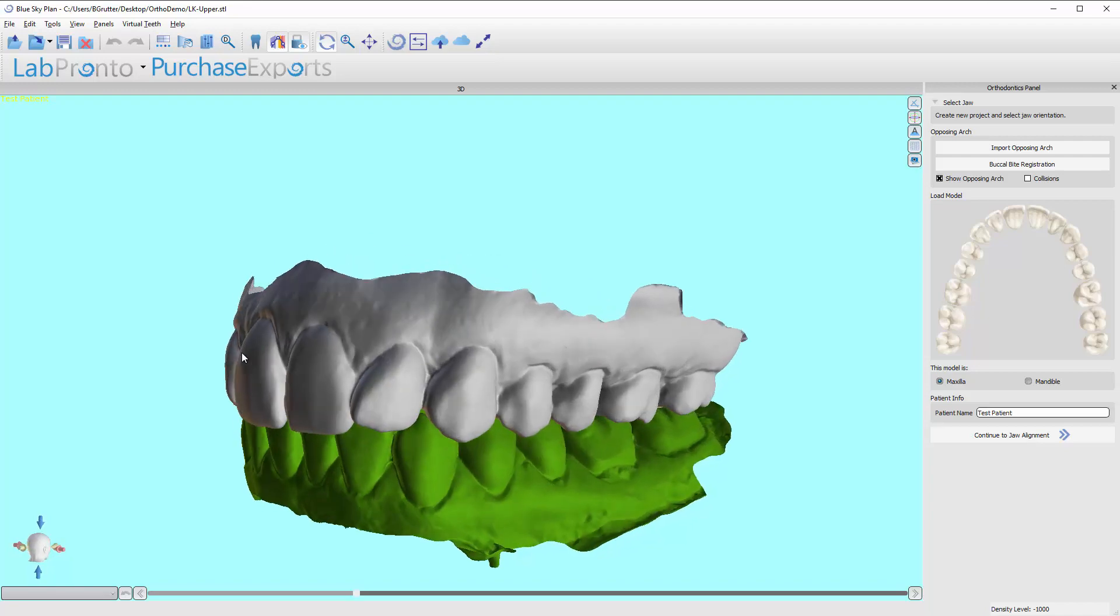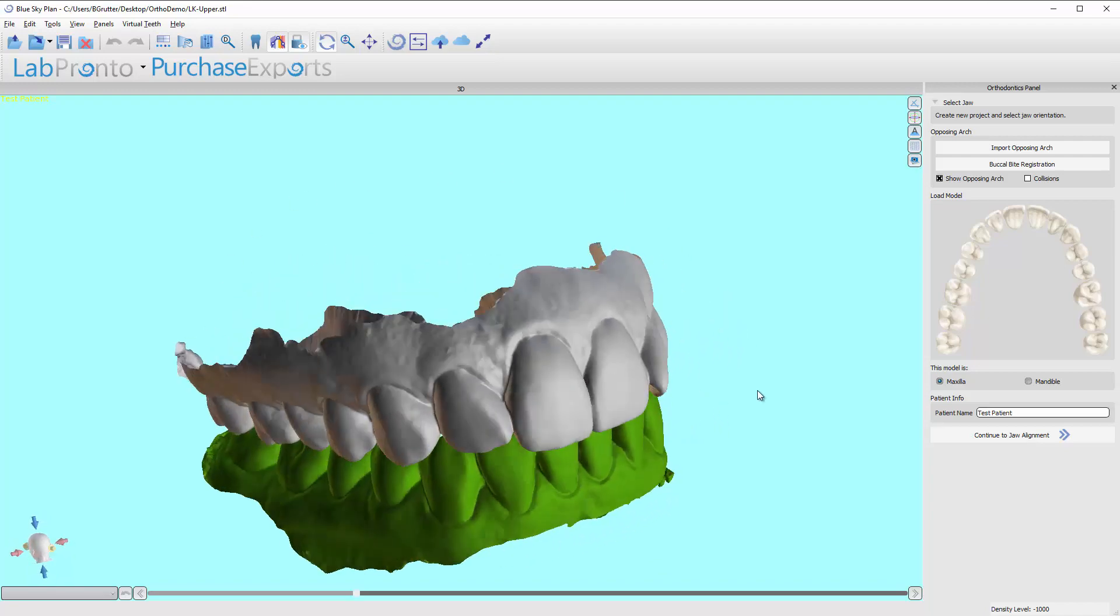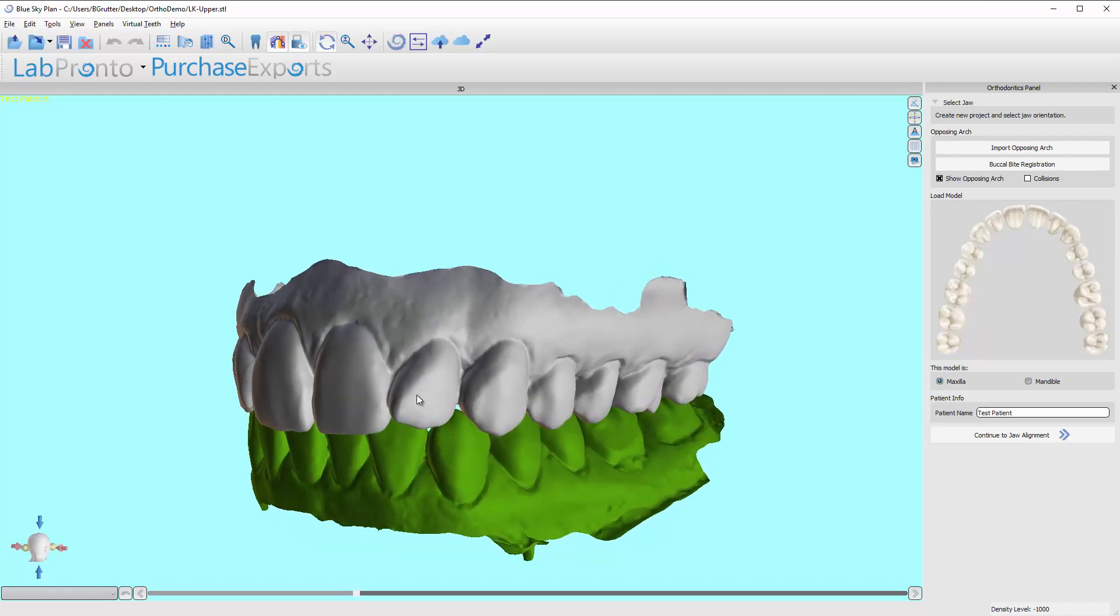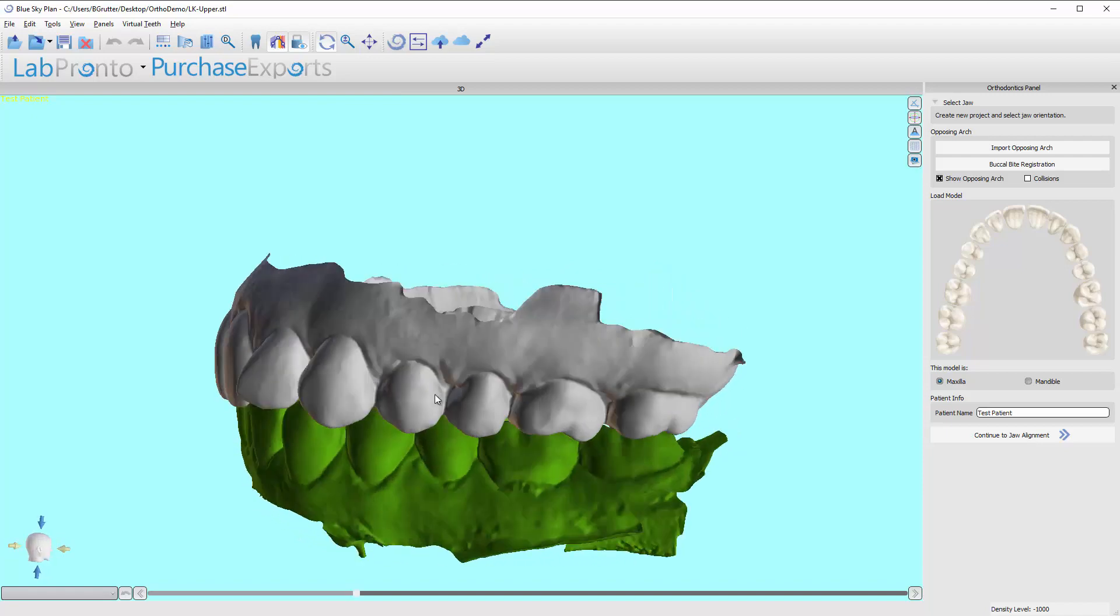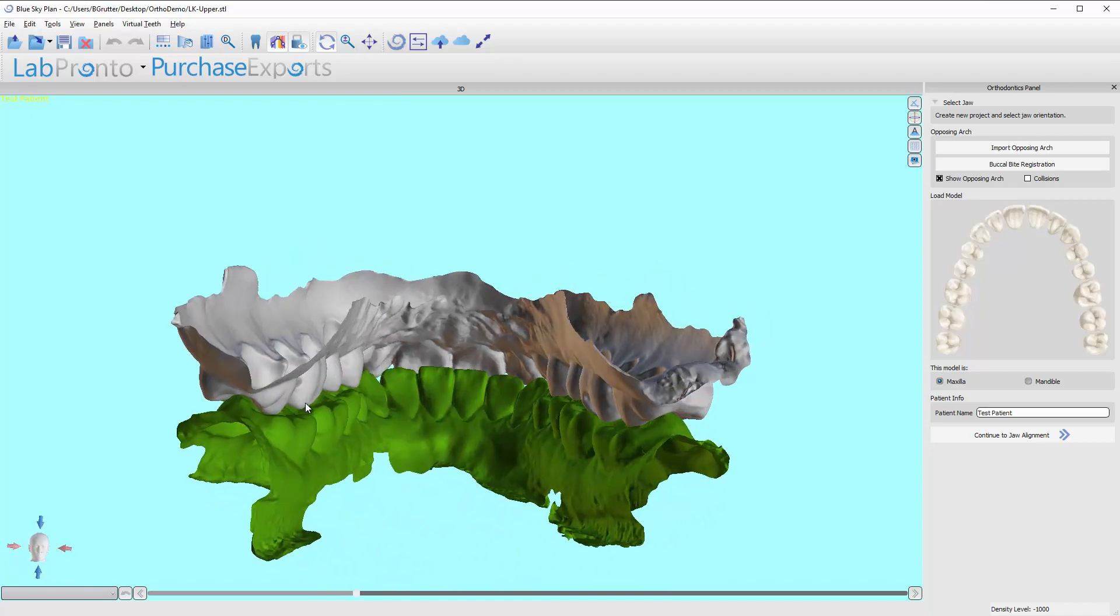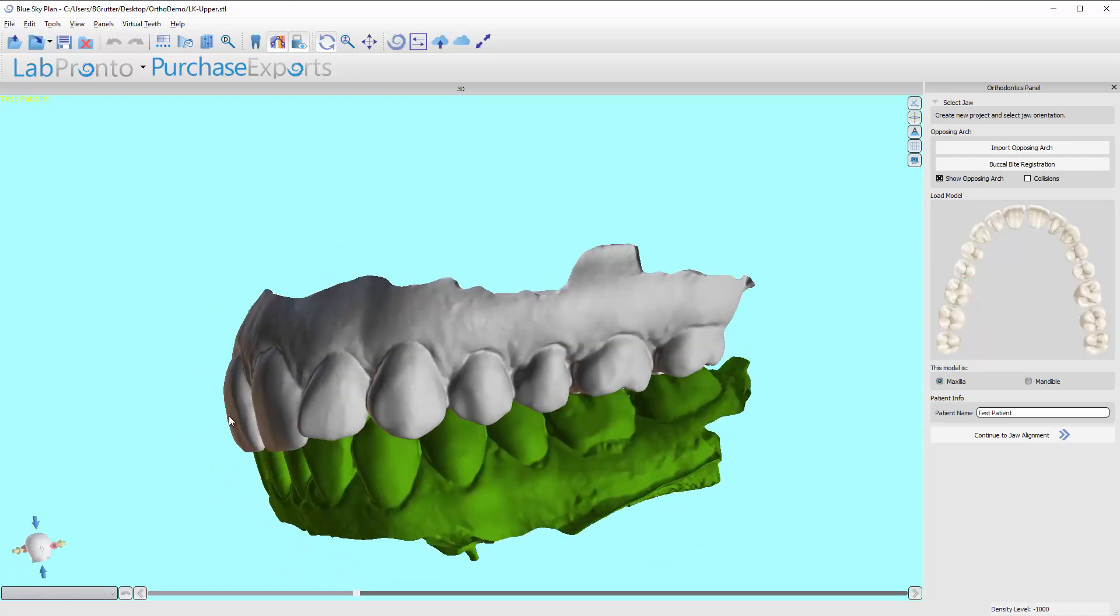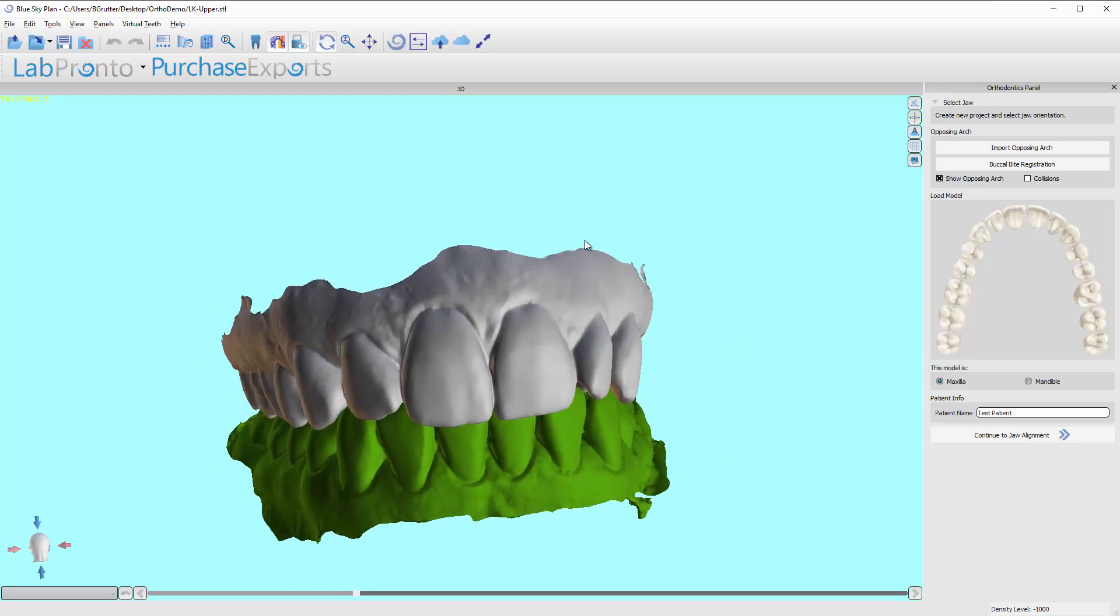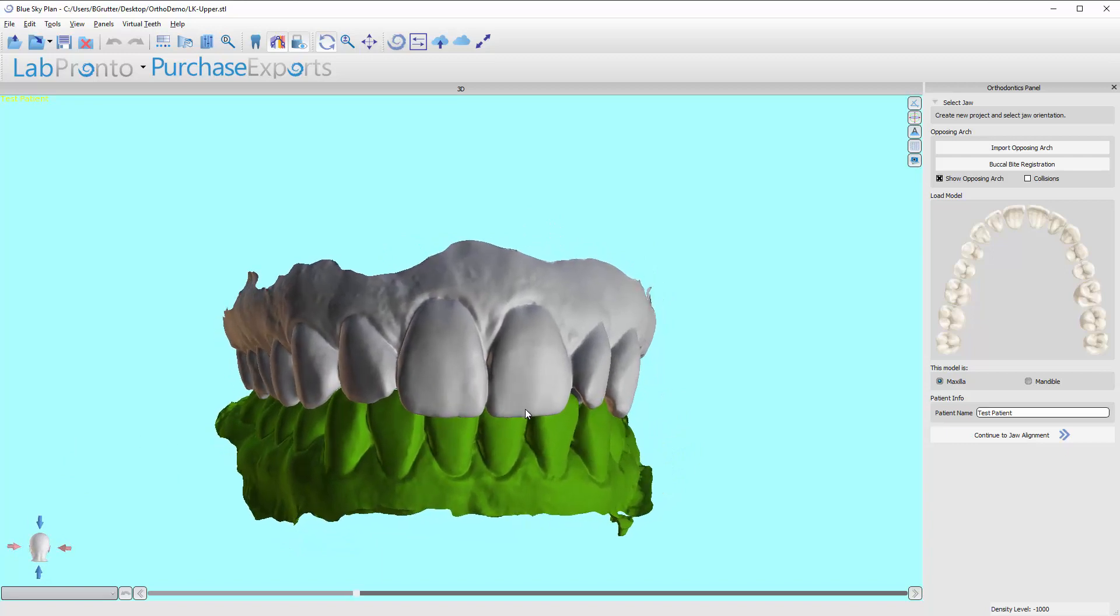And the 3D environment that these models are aligned to in CEREC is 180 degrees backwards to blue sky plan. That's why when I look at the front, I'm actually looking at the back. When I look at the back, I'm looking at the front. No big deal. The next step is going to fix this for us. So let me click here.